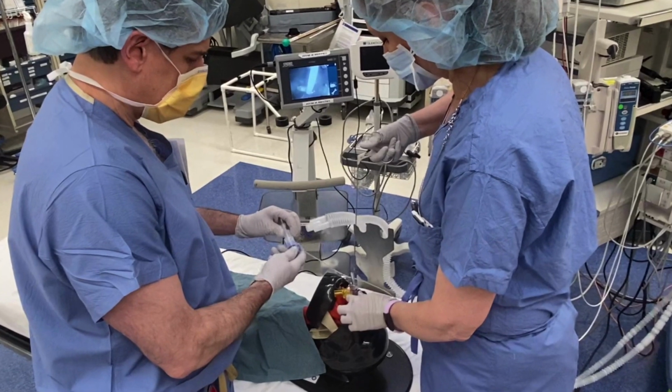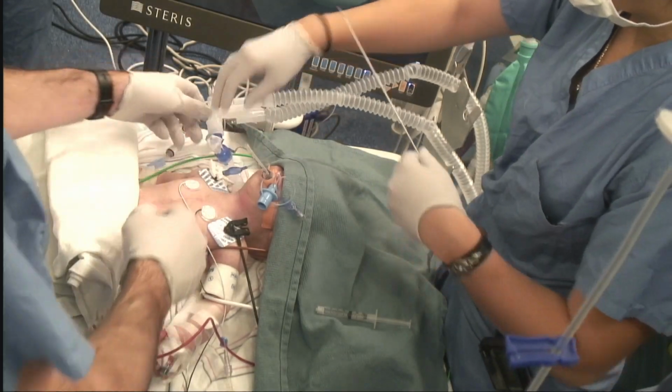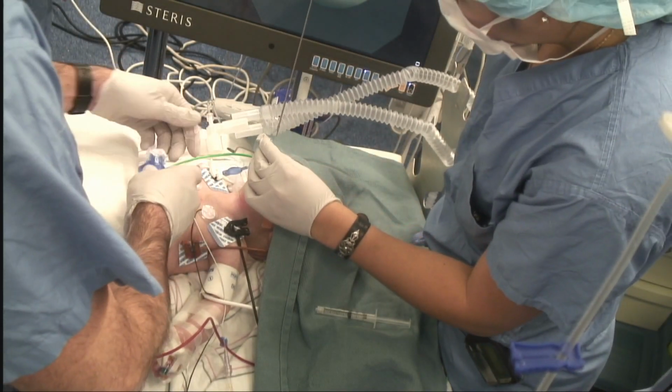Finally, a tracheal tube holder, better referred to as a stabilizer, is required to stabilize the tube in position as a supraglottic device is removed.